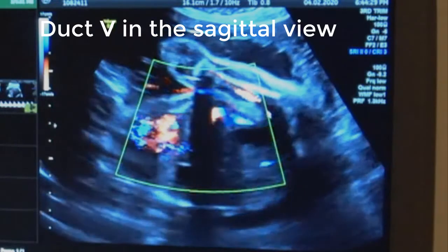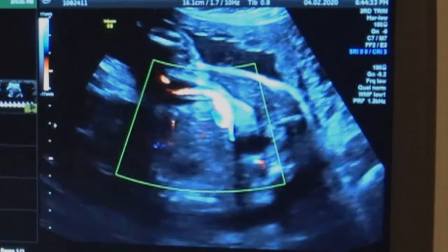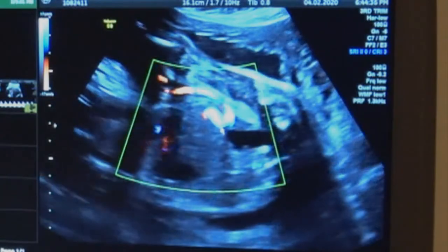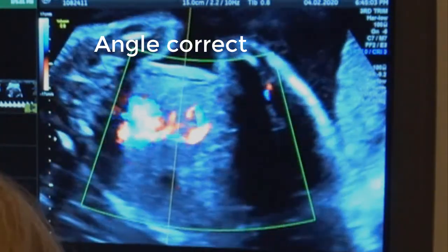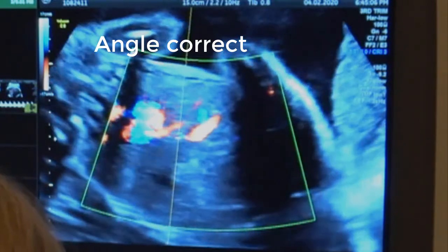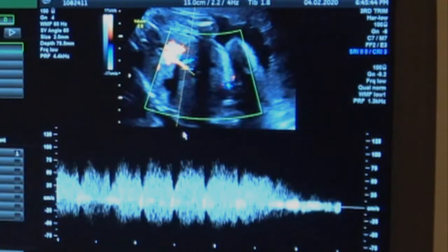So you come from the umbilical cord insertion, these are the little vessels coming in, and you can watch the vein come in. When it's horizontal, the Doppler signal's going to come in through both channels, forward and reverse. We don't have to do any measurements on the ductus venosus so much, it's more just to have a look at the shape of the waveform. PI, RI.